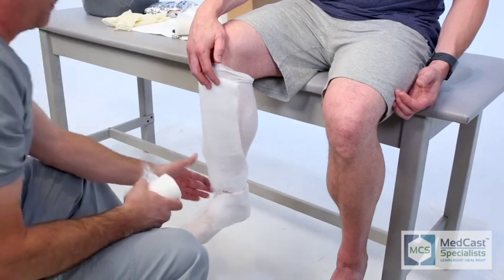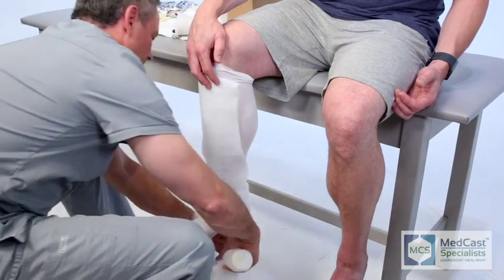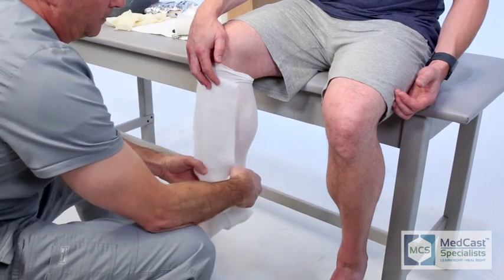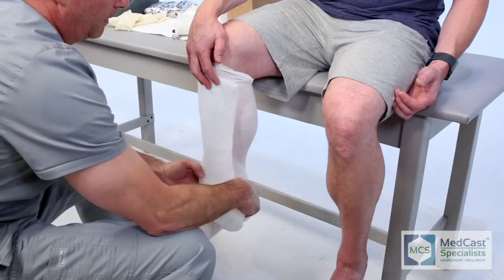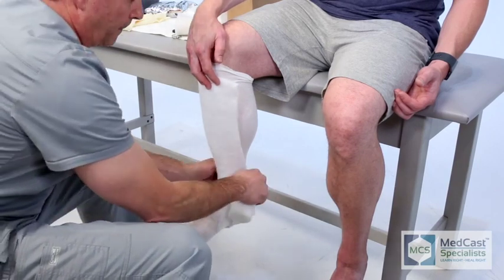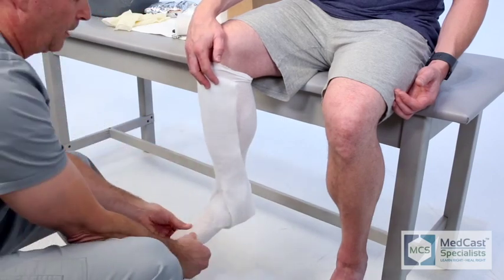Points of concern are definitely the heel, right where the Achilles inserts to the calcaneus — you want to make sure that they're padded well — and also the lateral and medial malleoli. Often times I actually put those on first and then I can put my anterior shin portion on over top of those.